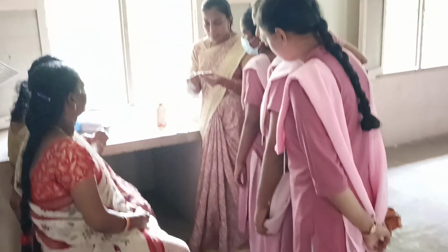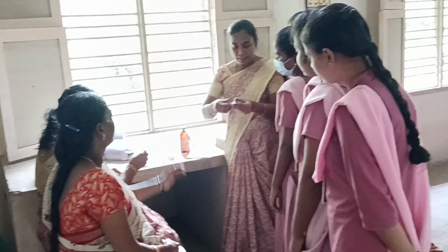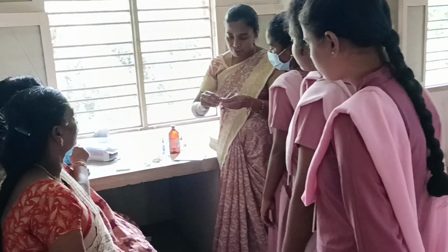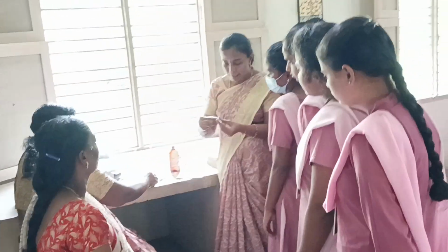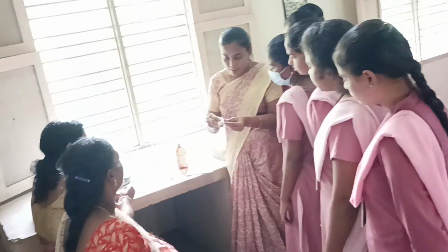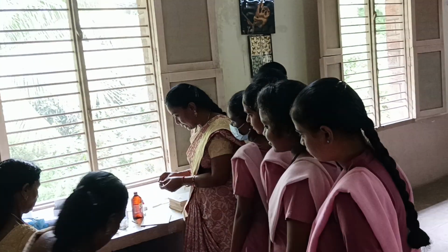A little needle can be used and then it should be disposed in the dustbin. For further use it is not recommended, because there is a possibility of using the same needle and transmission of different diseases.